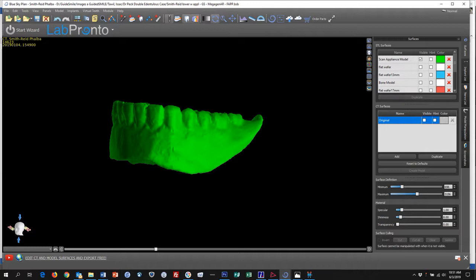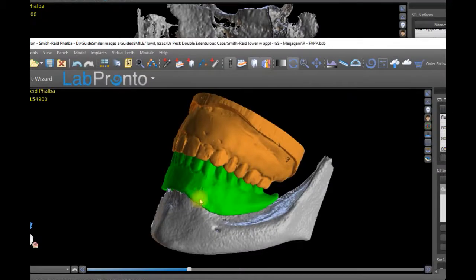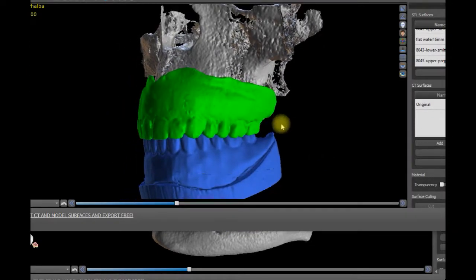Rest them on top of a piece of foam on the chin rest on the scanner, or sometimes a scan table that comes with the equipment. Either way, make sure that the scan appliances do not rest on plastic. They need to be up and floating on a very low density material like packing foam. Then you will export all 3 scans: the scan of the upper appliance, scan of the lower appliance, and the scan with both appliances inside the mouth. The important part of this is that the scan in the mouth captures every part of the patient from near the chin up to the nose.